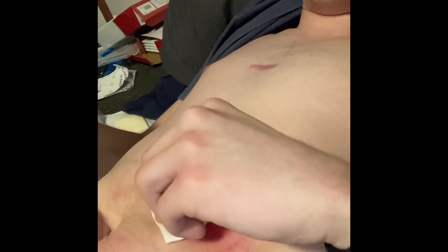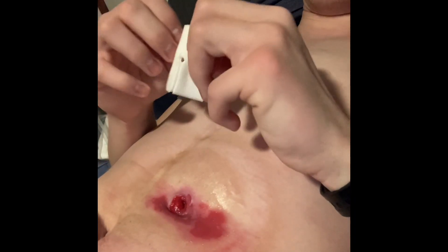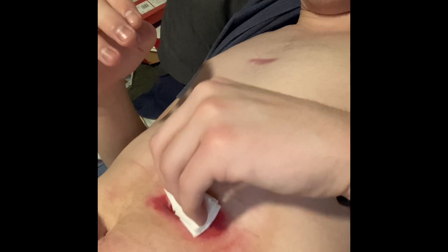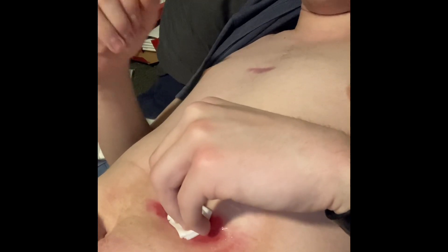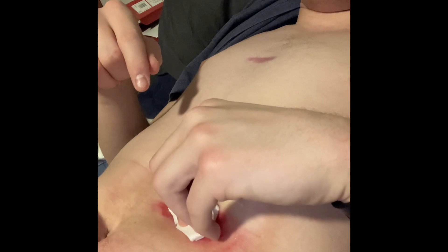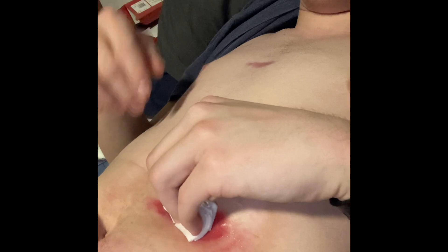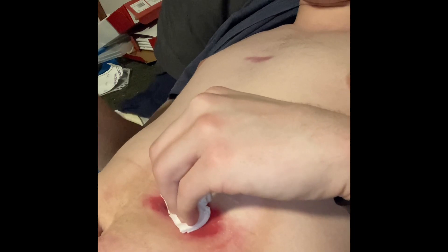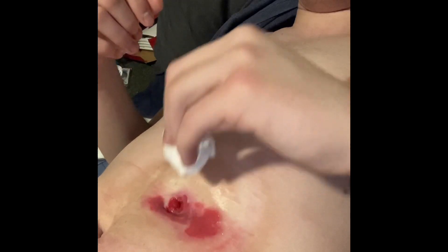When it leaks for periods of time and just sits there, it does this. If it leaks and I take care of it right away, it doesn't do that as much, but sometimes I don't get to it right away for many different reasons. And when you go to cough, always cover your hole — always cover the hole — because otherwise it'll squirt stomach acid all over and it will hurt really really bad.